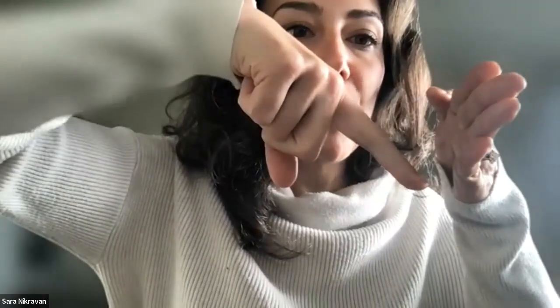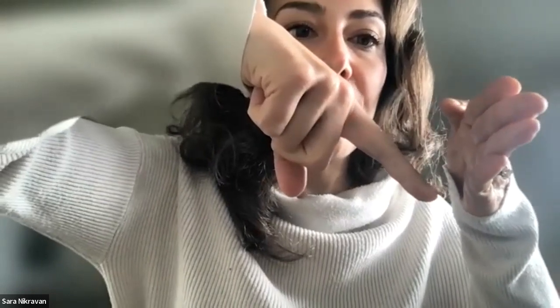And to Dr. Liu's point, thank you. Vibha, the technique we use, we call it the inchworm technique in a way. Because if you can see my hand, if your probe is like this and you're going out of plane, when you go in with your needle, every time your needle advances, your probe advances. So you're following the needle tip, and then it advances and your probe advances, so that you can always see where the needle tip is and you don't lose it.